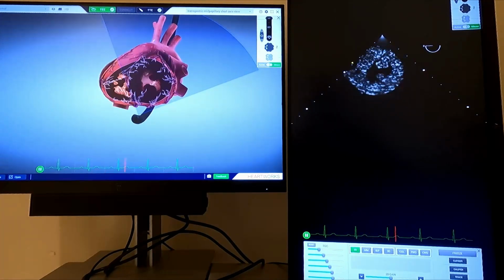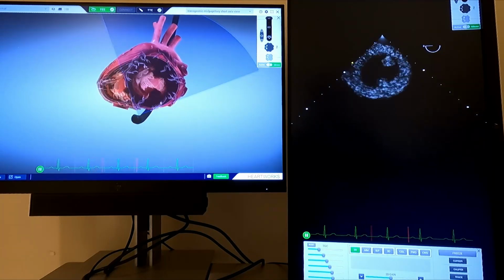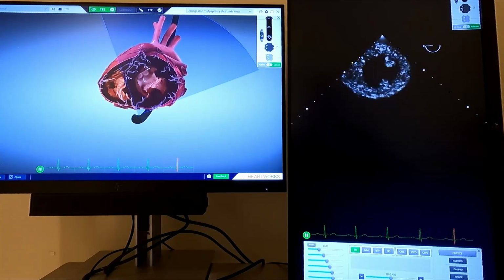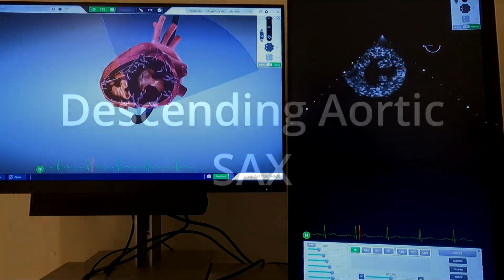This view is particularly high yield for the purposes of ICU or rescue echo, since it can be used to make rapid assessments of global as well as regional left ventricular function. It is the only view that images all three major coronary distributions in the same image.